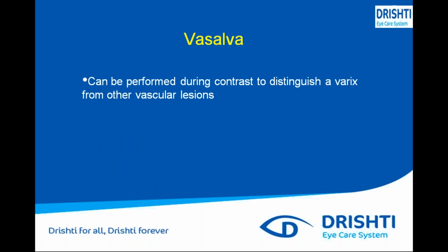So Valsalva, I have told you: we tell the patient to close the nose and mouth and blow air, and after that the scan is taken. Generally in pseudotumor and vascular lesions, the lesions inside the vessels can be diagnosed through the Valsalva.